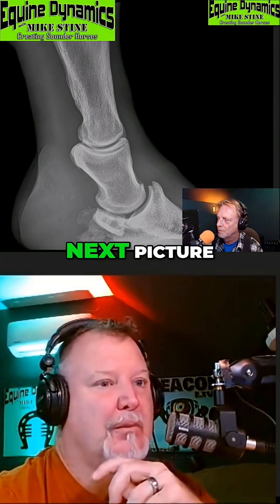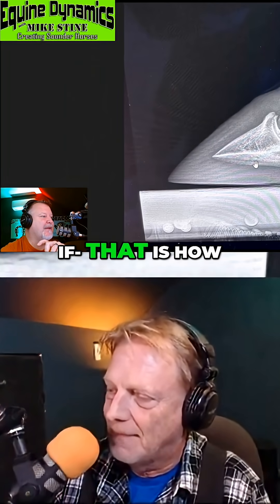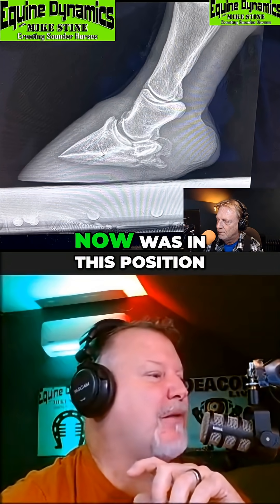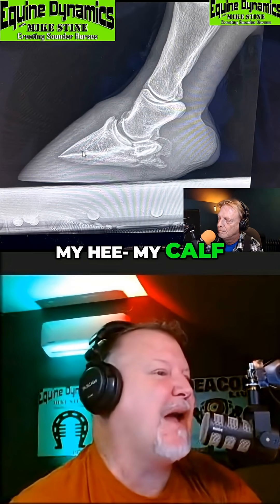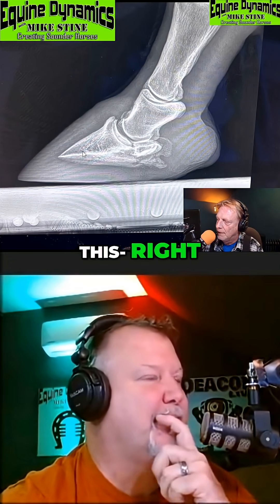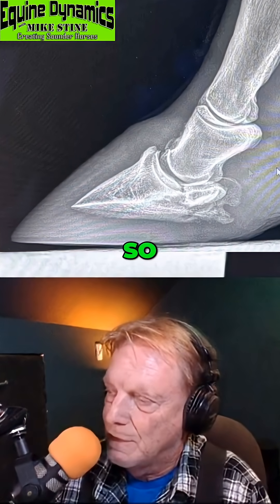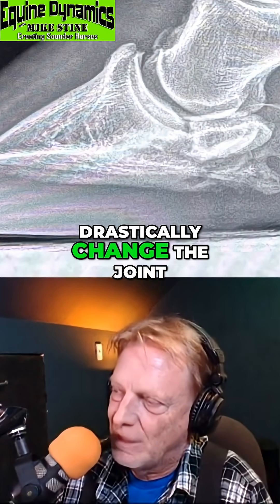Next picture — okay, so that is how the horse is standing on that left front. If my foot were in this position right now, based on the coffin bone angle, my calf would be so stretched out, so hyper-extended. And immature — I cannot flex that joint in my hand.